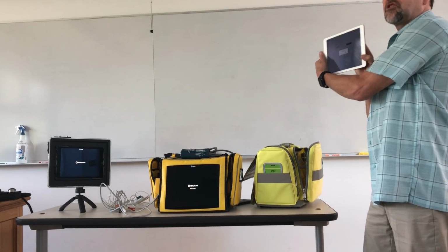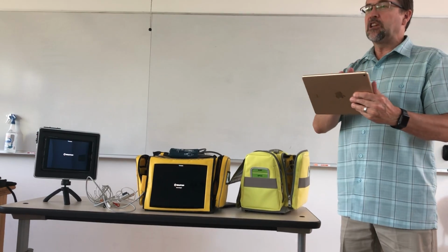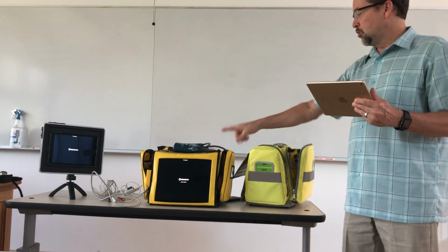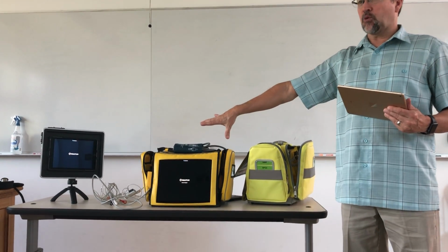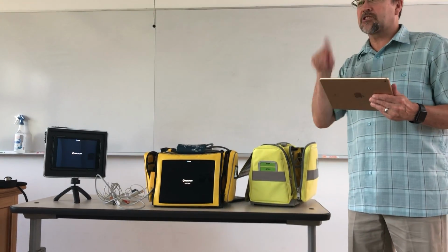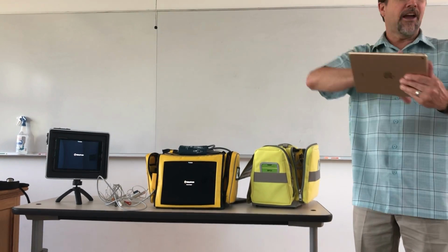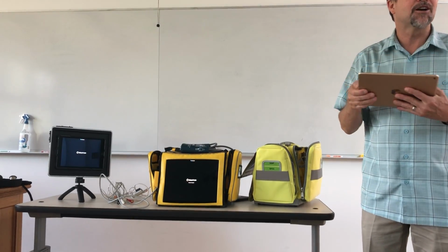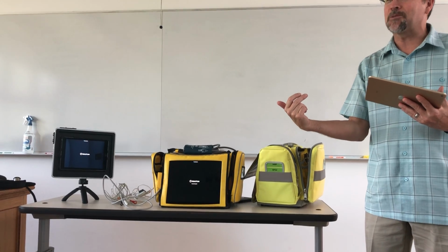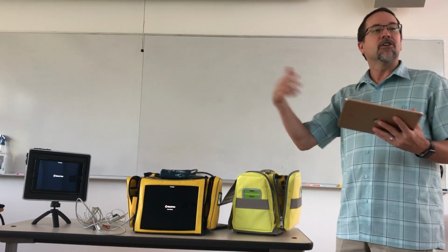The only thing they will see here is what you as a facilitator send to them or the little feedback screen. So if the person captured a 12 lead and you want the audience to see the 12 lead, then you hit the little send 12 lead button on the side of the facilitator, and then they all get to look at the 12 lead and decide for themselves whether they agree with their classmates' interpretation. Okay. They can vote on the performance while it's going on, and it'll pop up.